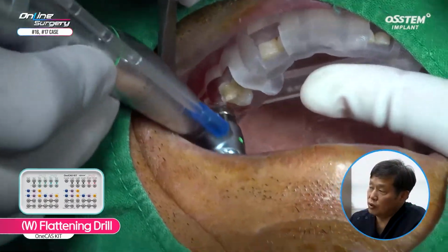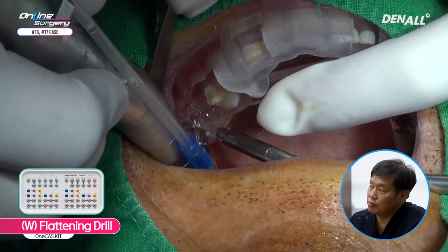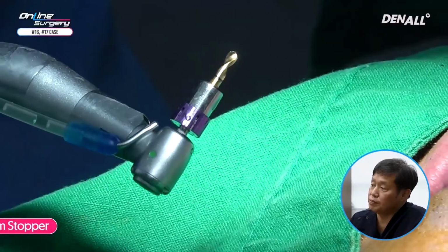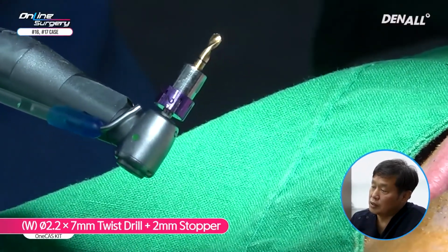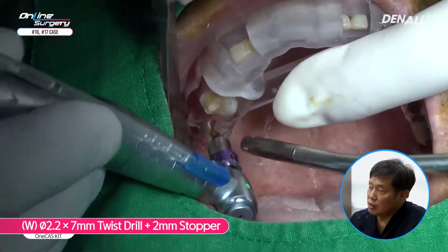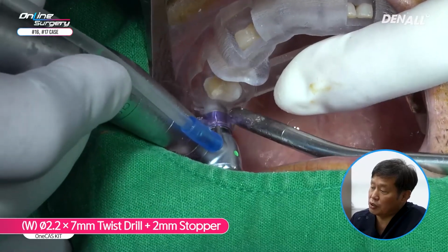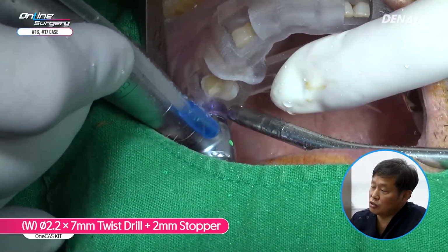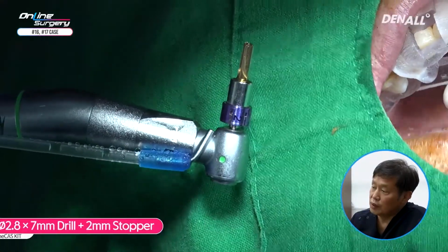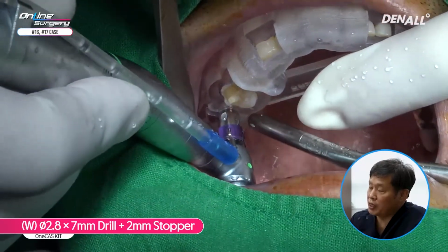Flattening drill is used from number 16. Number 16 and 17. A 6 millimeter length was assumed, so 5 millimeter drilling is done first. 7 millimeter with a 2 millimeter stopper. So initial drilling is done up to 2.2 using 5 millimeter. 2.8 by 7 millimeter drill and 2 millimeter stopper.